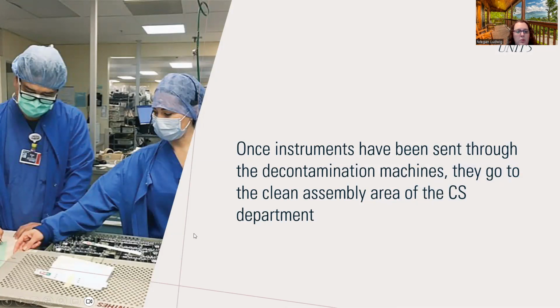They don't have to use gloves to reassemble those trays. That way, they can ensure that all the pieces are there, and none of them have any broken pieces. They're going to inspect for safety, etc. So it's really mostly just separated by that washer decontaminator, and it'll come out clean on the other side.